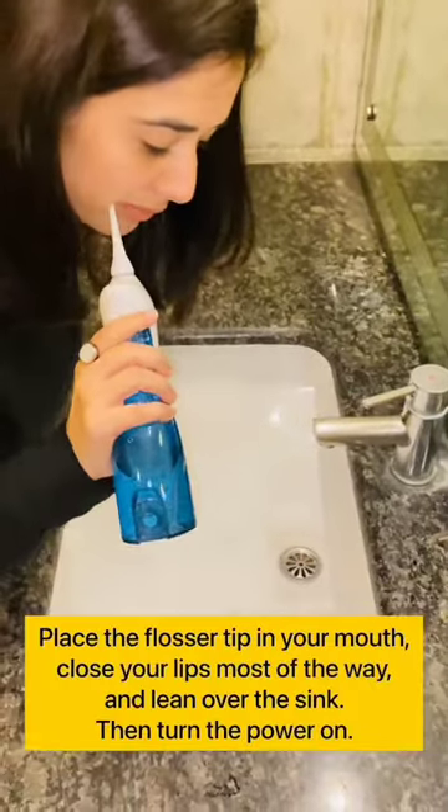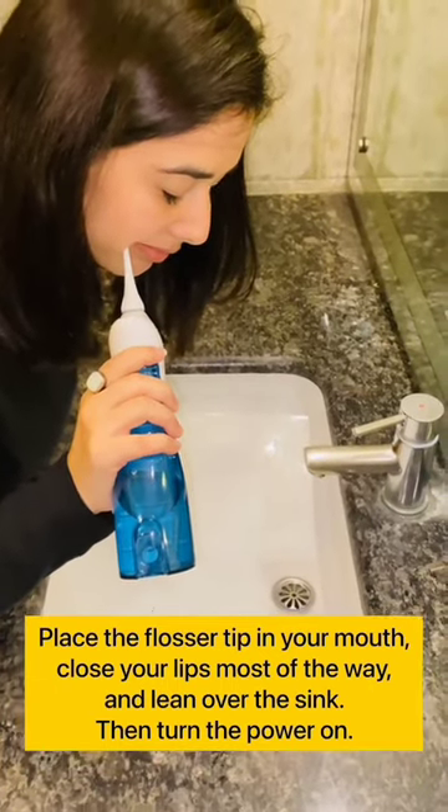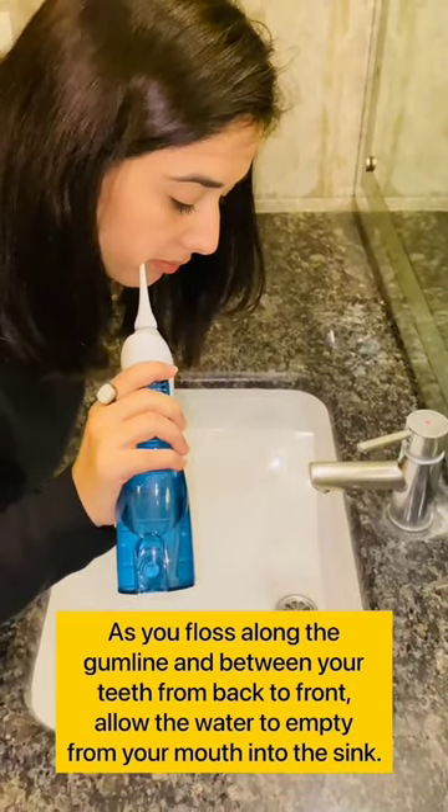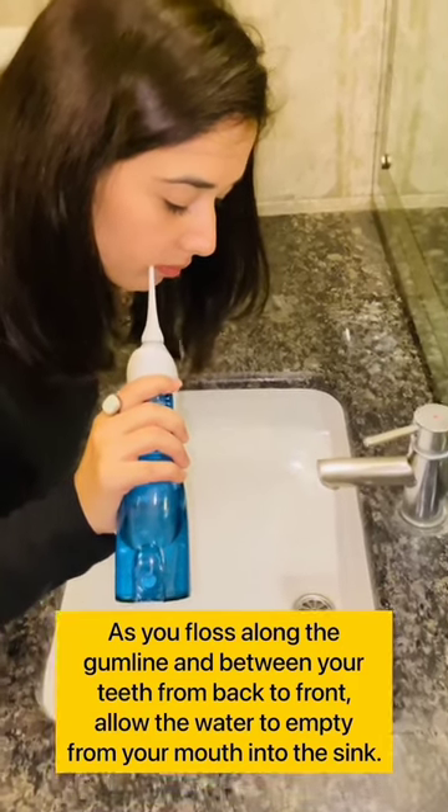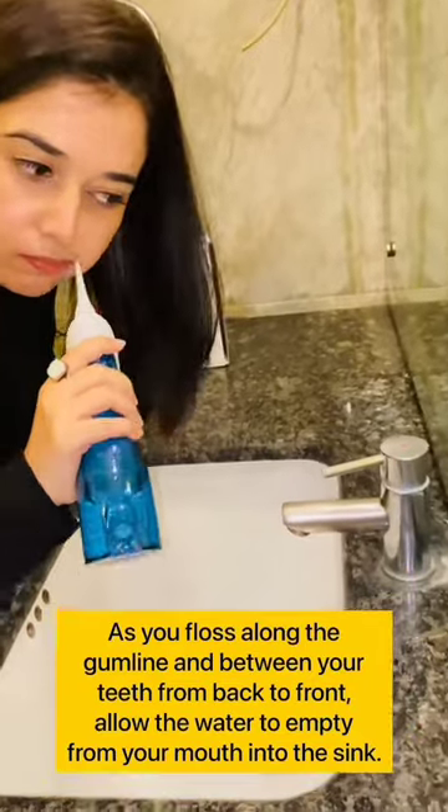Now let's learn the technique. Place the flosser tip in your mouth, close your lips most of the way, and lean over the sink. Then turn the power on. As you floss along the gum line and in between your teeth from back to front, allow the water to empty from your mouth into the sink.